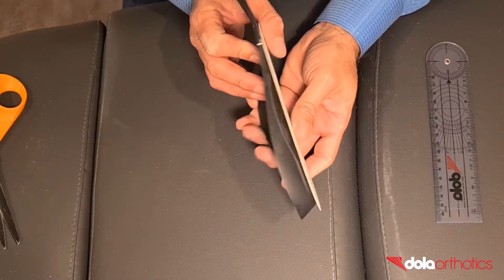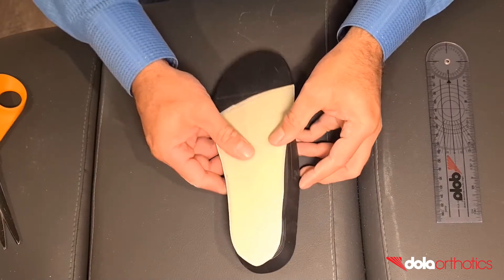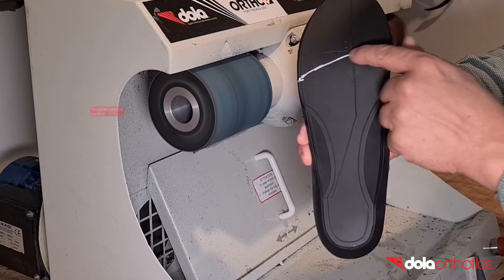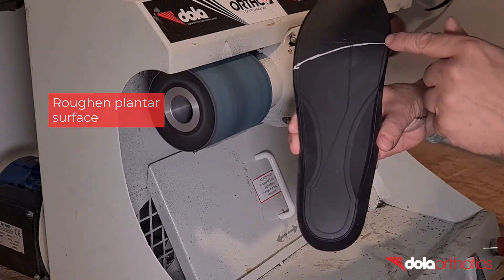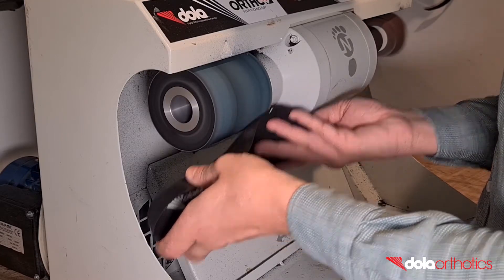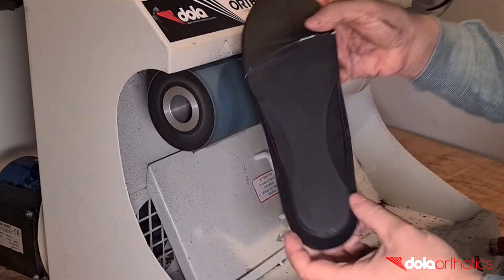The flat plantar surface of the DOLA Pro is designed to make the addition of plantar modifications in clinic fast and easy. To aid in gluing, roughen the surface of the orthotic where the DOLA tech plate will be adhered to. Start by grinding the anterior border near your guideline then connect to the heel. This roughened surface will improve the adhesion of the plate to the orthotic.